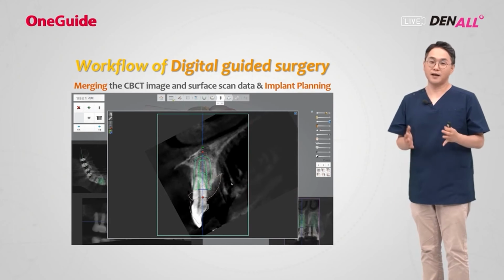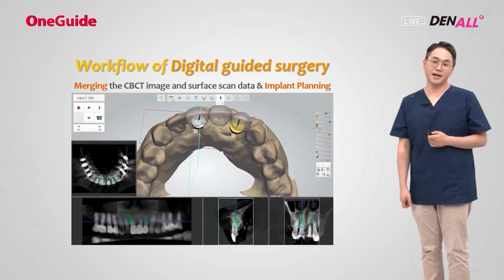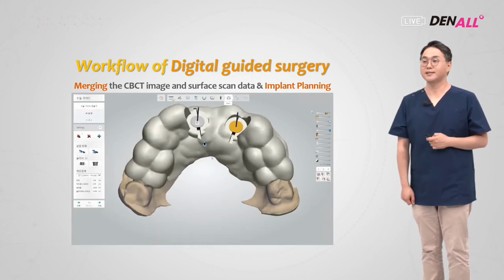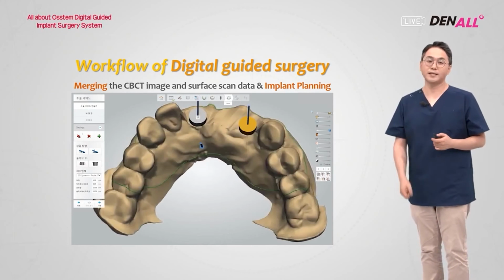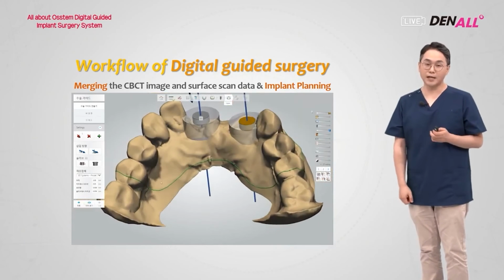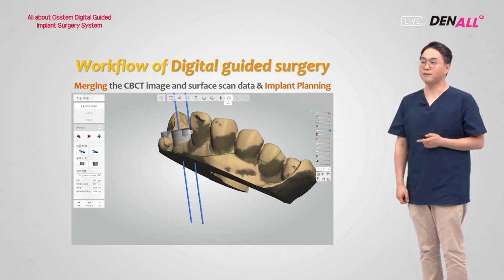The plan position. If you like everything, following this position, drilling and implant placement needs to be guided by a surgical stent, and this stent is created here, like this. Implant position and angulation is confirmed, and after that, the guide hole is created. To support this, additional elements are encompassed in the surgical stent. The margin of the surgical stent can be adjusted.